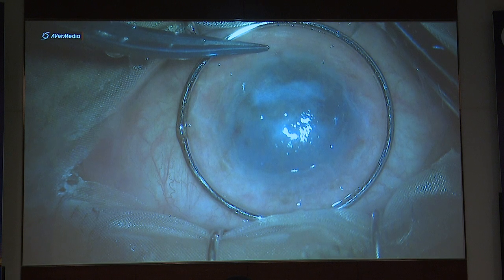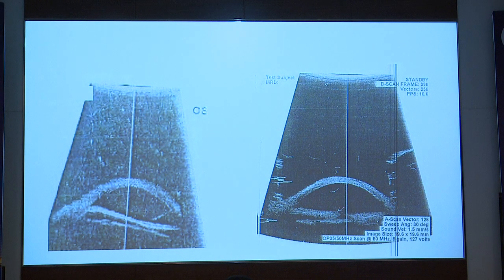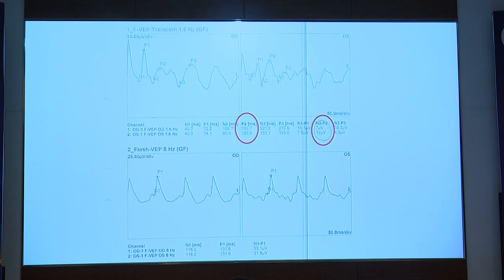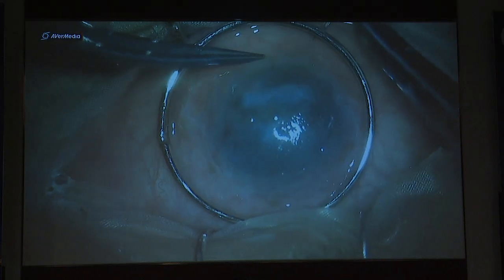Coming to the next case, this is a case of chronic PBK for more than 10 years. Limbus does not look too good, but patient was very highly motivated to undergo a surgery. So did a UBM and saw that the IOL was tilted. Ultrasound was okay, mild vitreous echoes. Did a VEP and found that amplitude and latency was also normal. So went ahead with the full thickness penetrating keratoplasty.